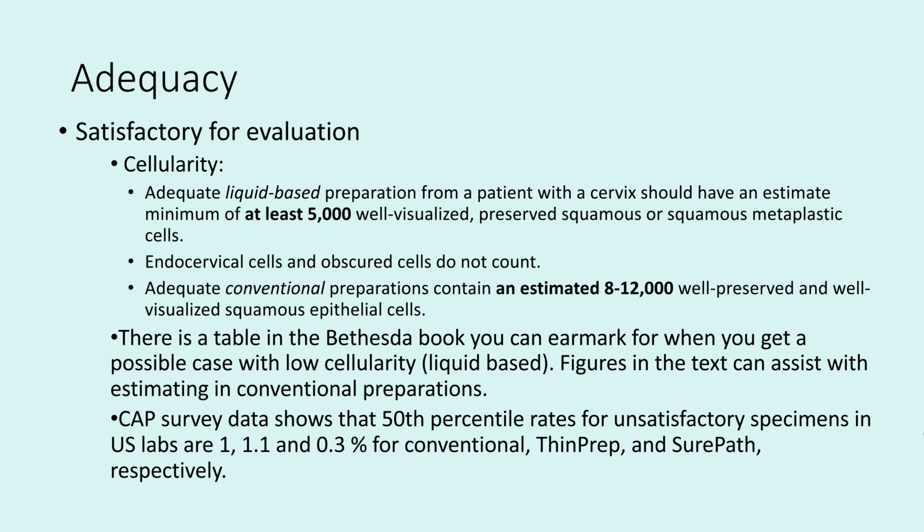It's no longer required. However, if you see sampling of the transformation zone, i.e. squamous metaplastic cells or endocervical cells, you have to note it. And adequate sampling of the cervical transformation zone is 10 endocervical cells or squamous metaplastic cells. So it's still, if you see it, you put it in the report, but you don't have to call something inadequate just because it's not there.